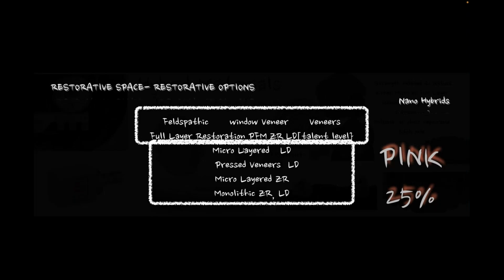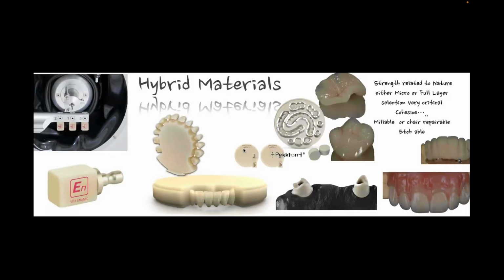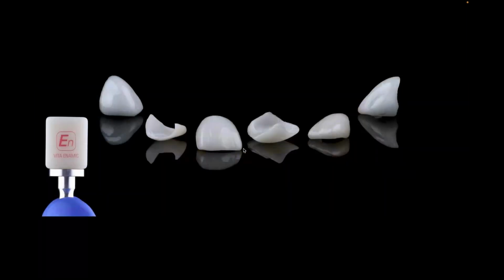When I talk about nano hybrid materials, in the VITA world, I'm really talking about Enamic, and Enamic is a great material. And yes, I've used Enamic for veneers on many occasions. I've used them for long-term provisional veneers. I've also used them for final veneers. And really where I tend to use them is on younger patients.